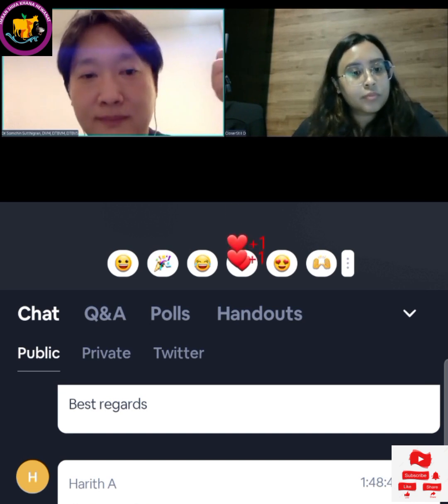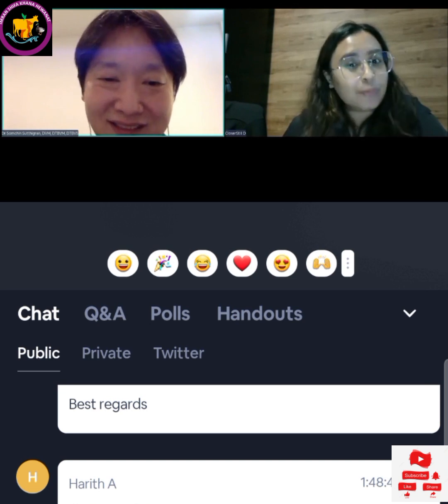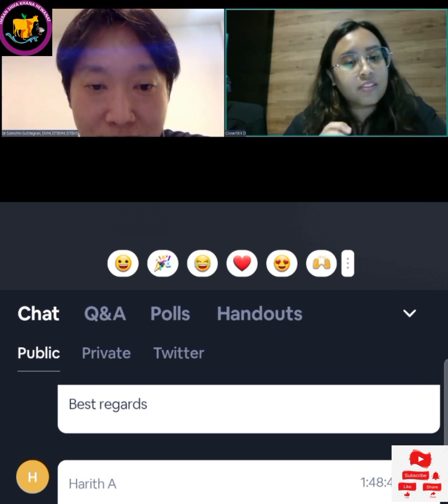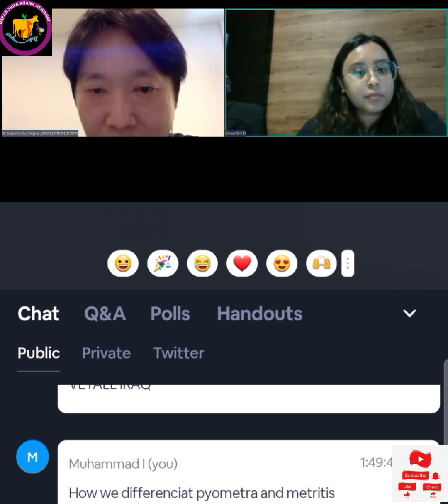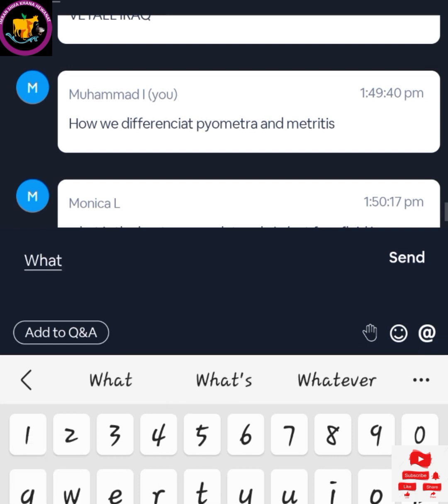Lovely. All right, so for the next question we have coming in from Dr. R. So in severe splenomegaly, where will be the boundaries of spleen? Will it displace the other organs? Please, I lost signal. Oh, sorry. Would you like me to repeat the question? Yes. Okay, so in severe splenomegaly, where will be the boundaries of spleen? Will it displace the other organs?